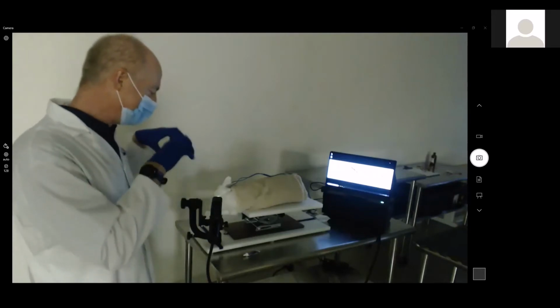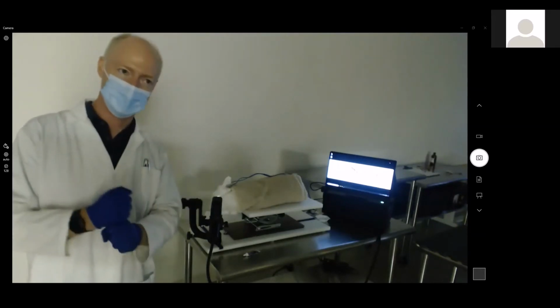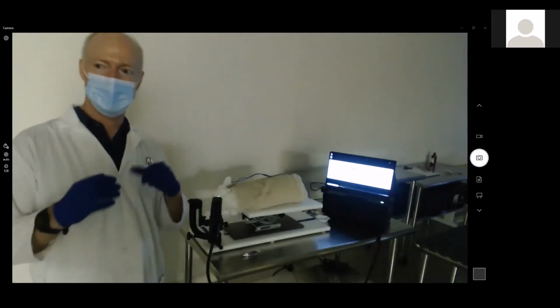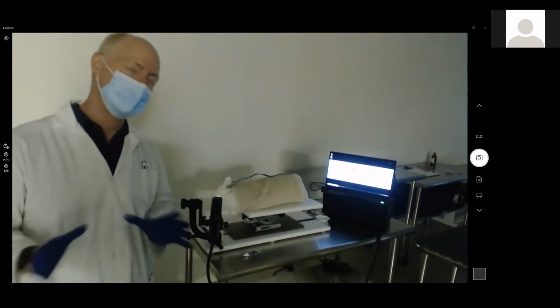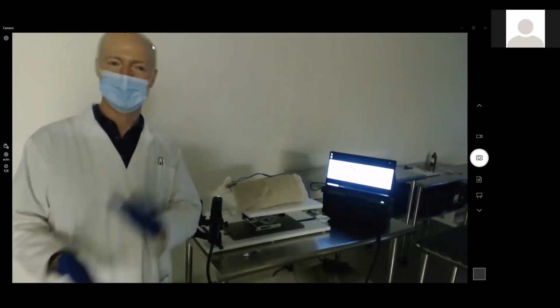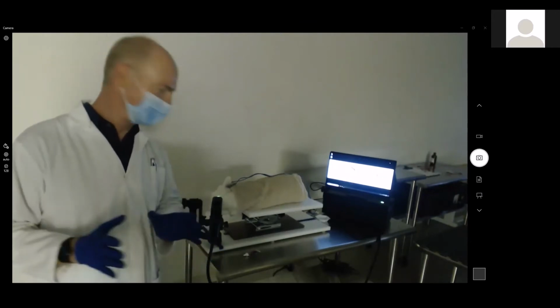We're going to take off this handheld, put it off the scanner, and put it on a handle. Then I'm going to grab my new family member, my new dog Axon, put him on the table, and do a very quick OCT examination. I'm going to attempt to grab his cornea, and I'm going to try to grab his retina, and we'll see how that goes.